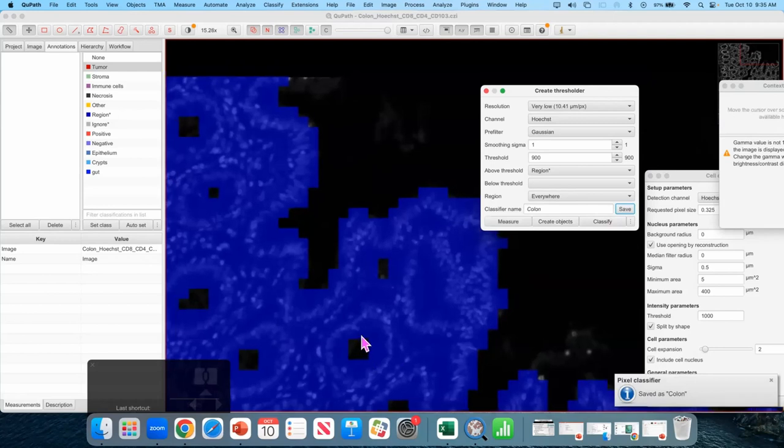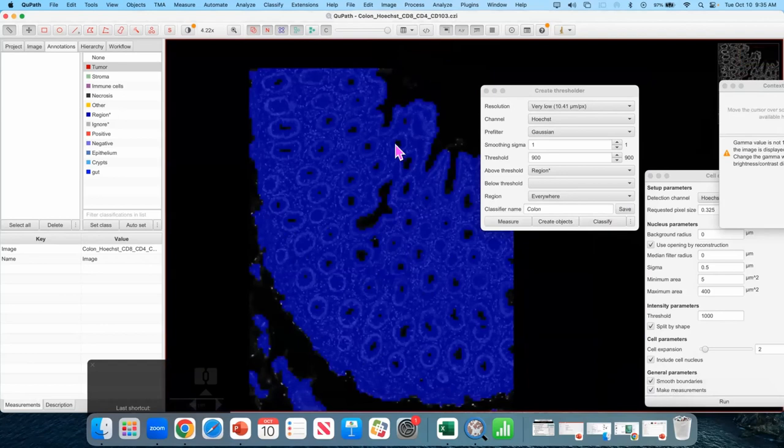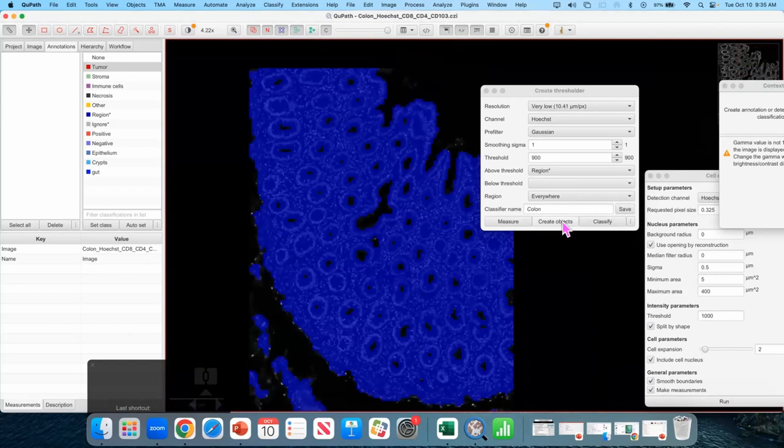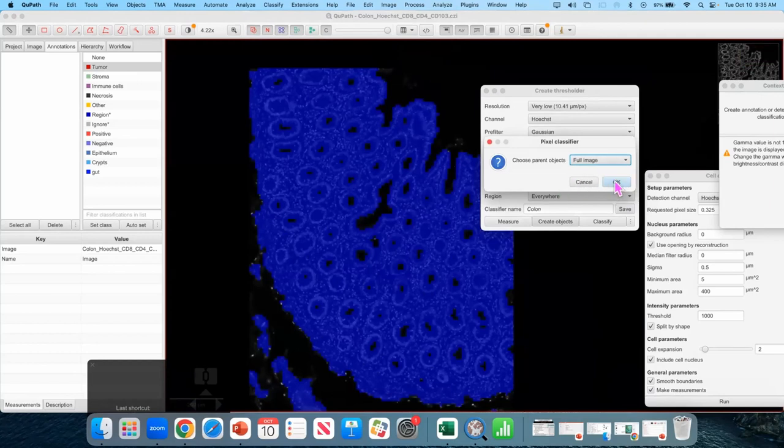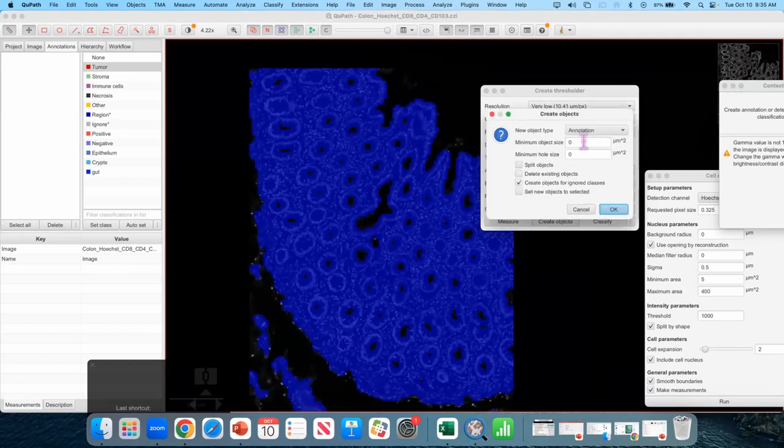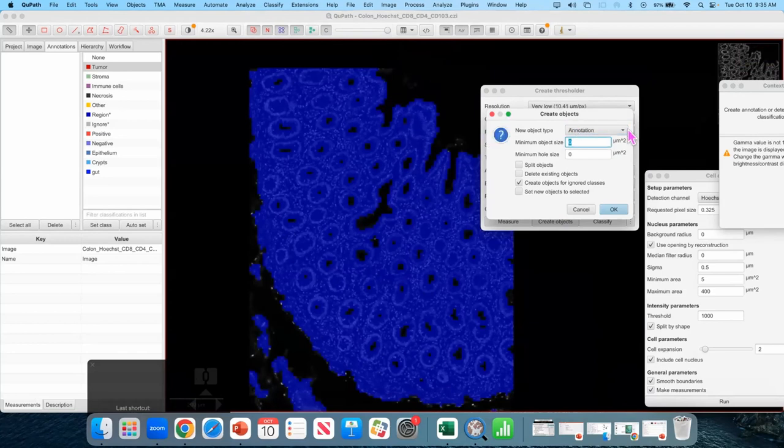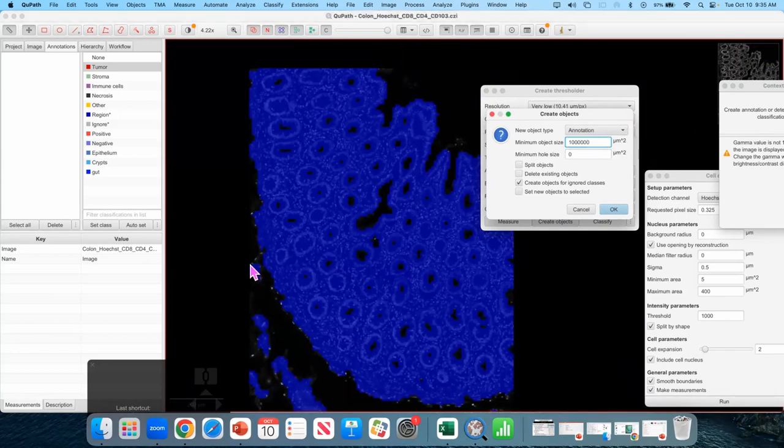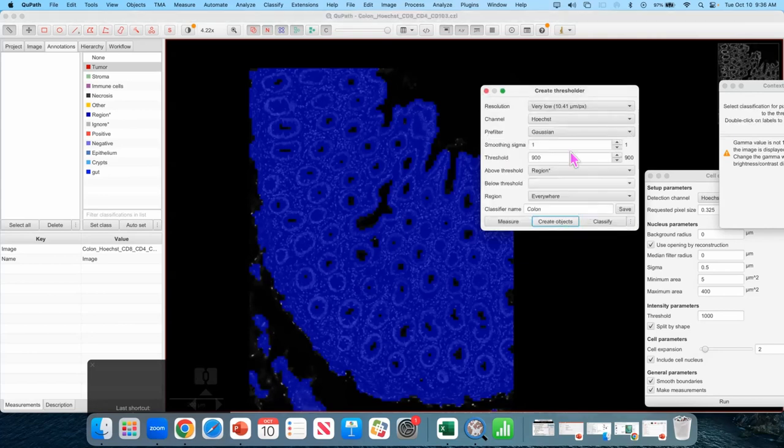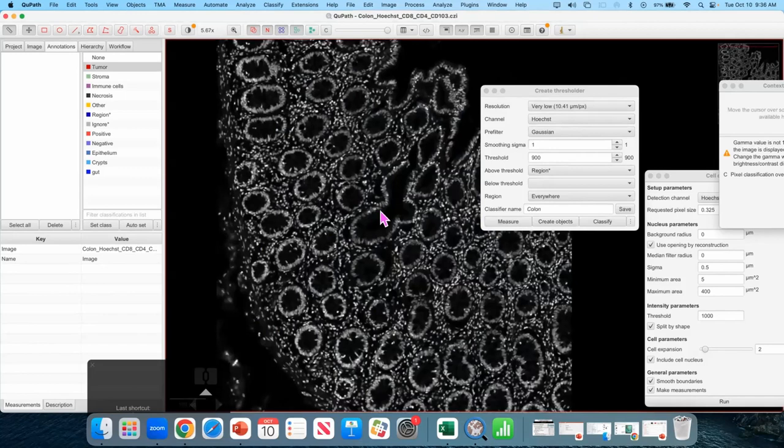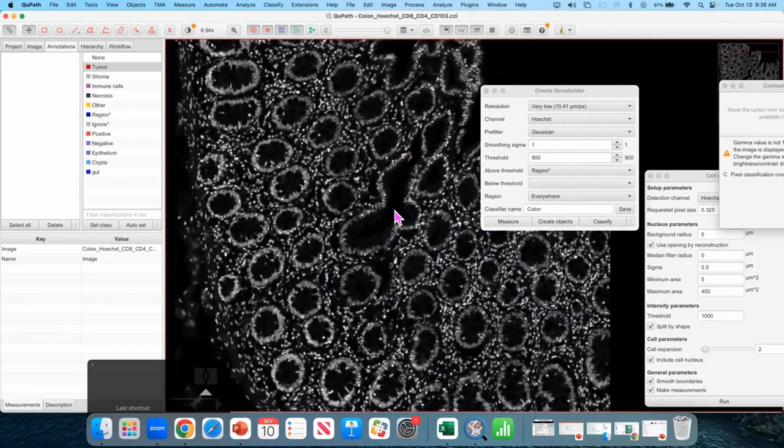These are pretty small images so even if you go like high it'll not so bad. The other thing that you can immediately see as you get more resolution sometimes the results can actually be worse. I want to count the crypt inside as part of my tissue which it really is. I don't want to remove all that so I'm going to go back to very low. And I still think my threshold's a little too high because like it's not getting to the edge. So let's drop that down to 900. Notice the updates and triggers when she clicks on something else out of that. Yep. Give it a name and hit save. So I now have saved this classifier and I'm going to create objects. I want to create objects for the entire image.